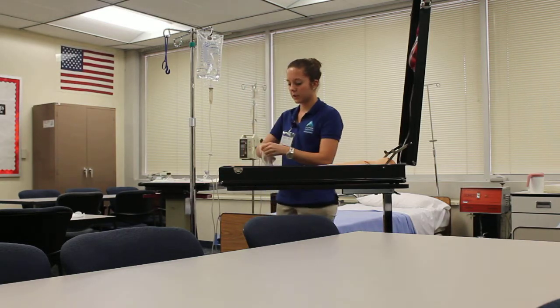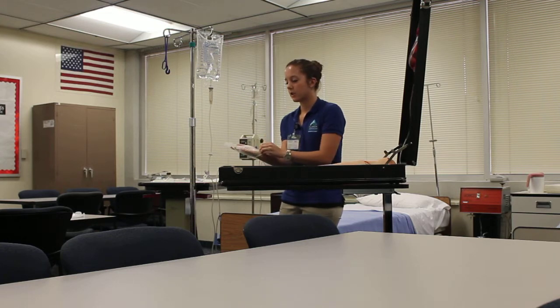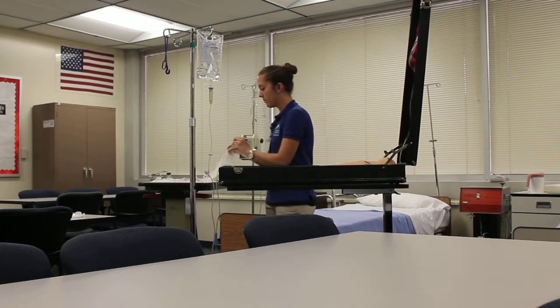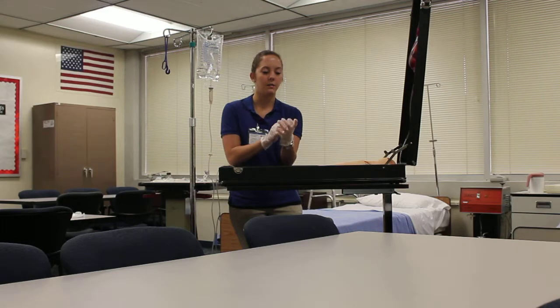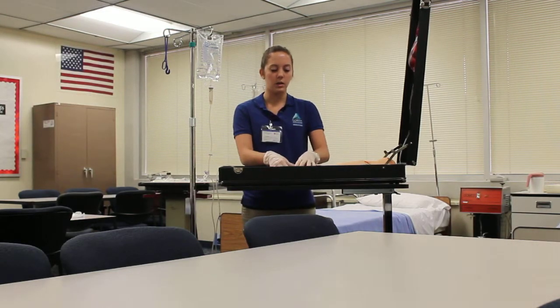I'm going to explain the procedure to the patient, let them know that they are getting Rocephin through an IV for their infection. I'm going to tell them about their lab values, any kind of signs of an allergic reaction or adverse reaction. I'm going to palpate the IV site and look at it, make sure it doesn't have any phlebitis or infiltration. And it doesn't, so it's good.